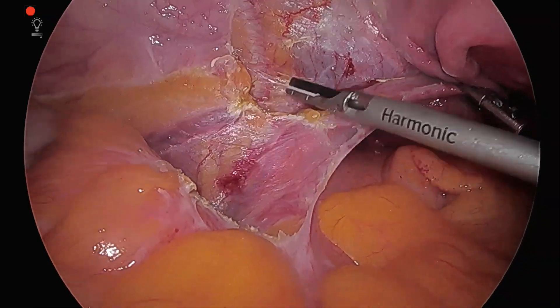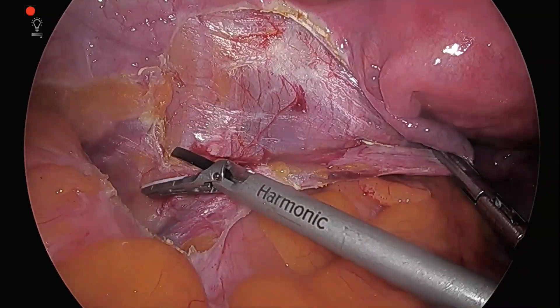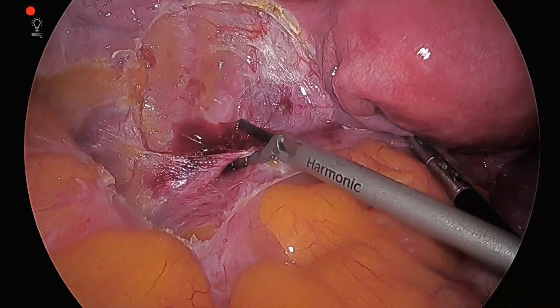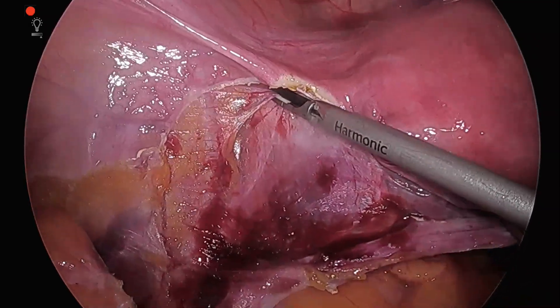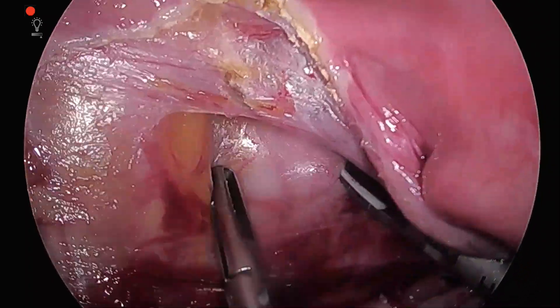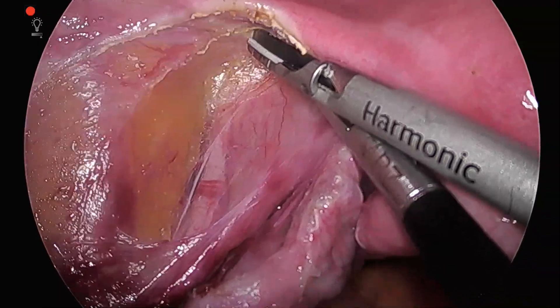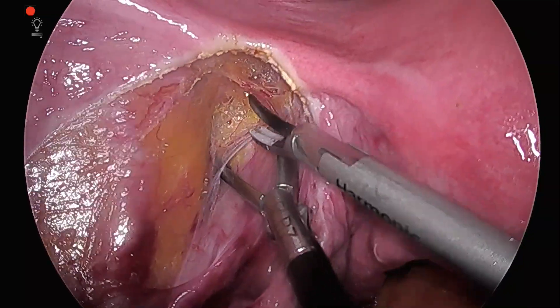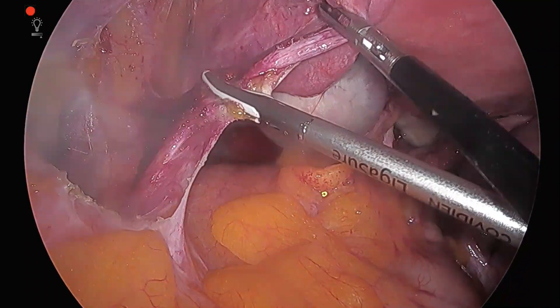You can see the external iliac artery coming into picture. Now we can see the ureter very clearly — the internal iliac artery and the ureter sitting adjacent to each other. The ureter is mobilized and kept ready, just in case it is adherent to the endometriotic cyst.